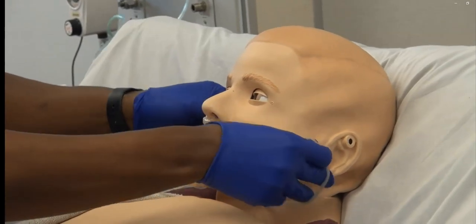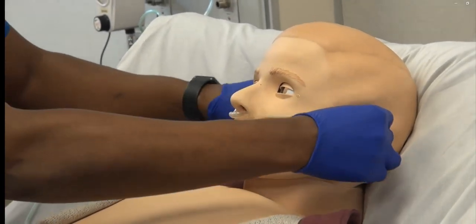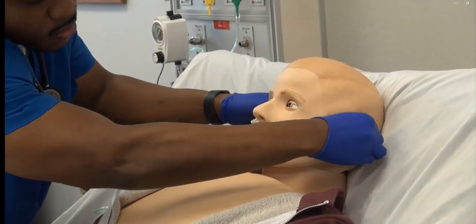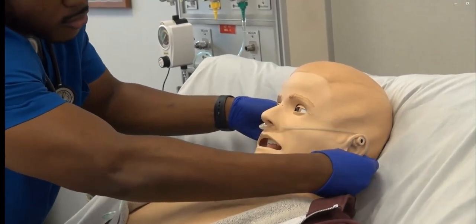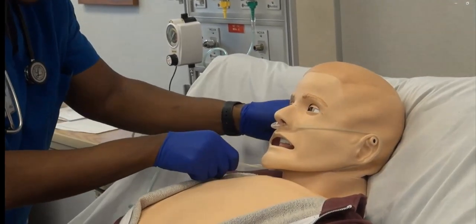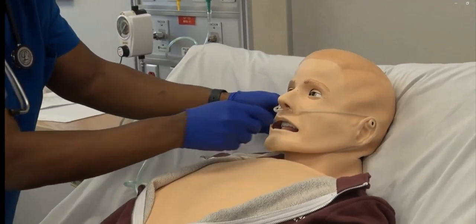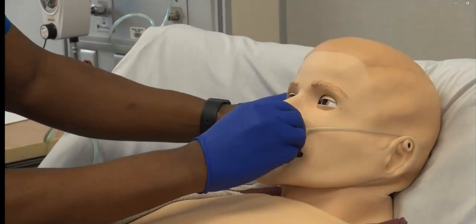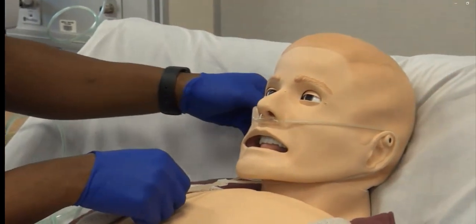When placing the cannula, make sure that the prongs of the nasal cannula are facing down and that you will loop the tubing around each ear. Then adjust the straps at the neck so that the tips remain in position. Then instruct the patient to take a couple deep breaths through the nose.